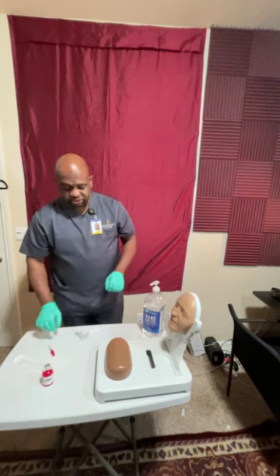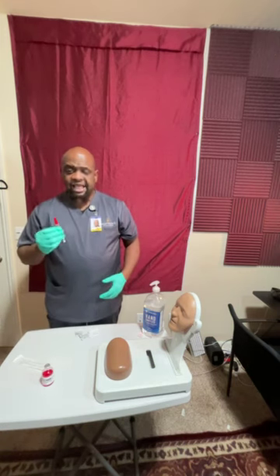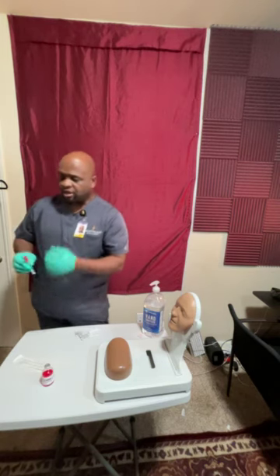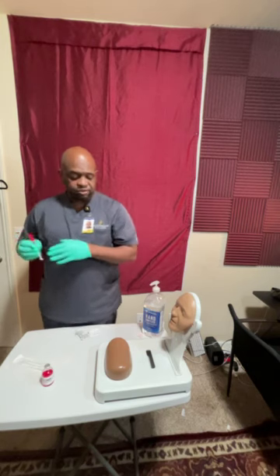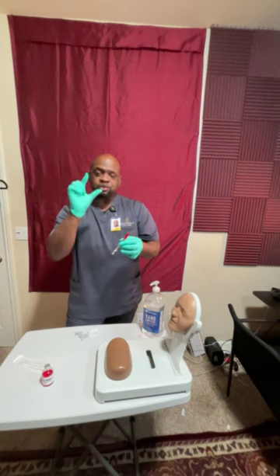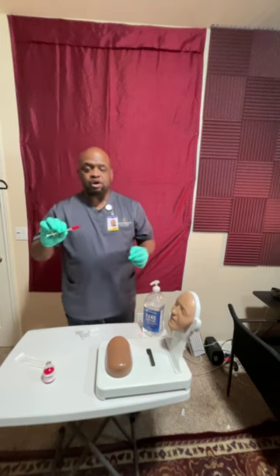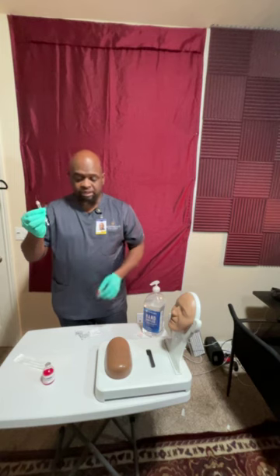While that's air drying, I am going to go ahead and with the medication again, do the third check to verify, checking the medication against the MAR, right? On this third check, I'm checking the 6 rights. Everything looks good on the 6 rights. Now I can go ahead and work on administering the medication. With my thumb and my forefinger, I'm going to hold the syringe this way, making sure that the bevel is always up. And I'm going to remove the cap. This is all done with my dominant hand.